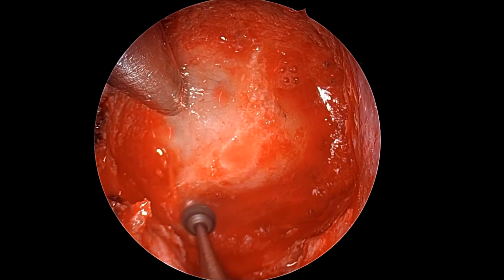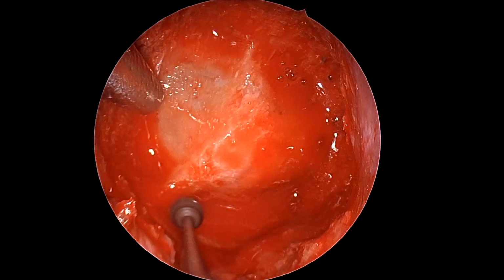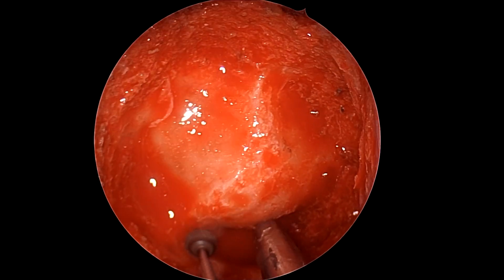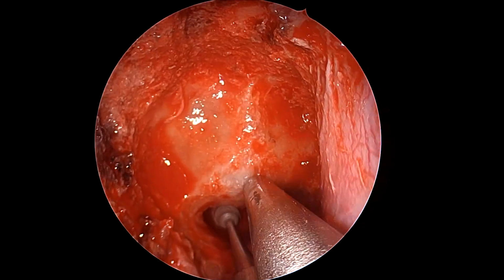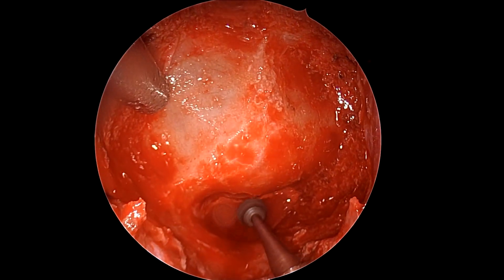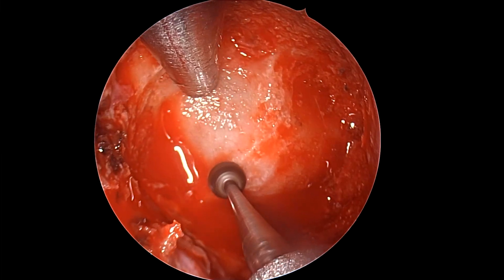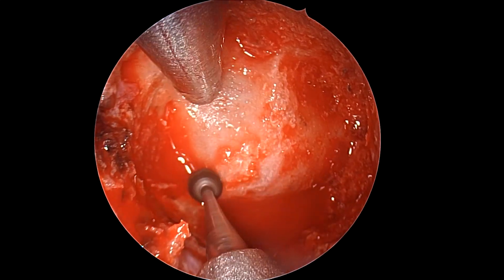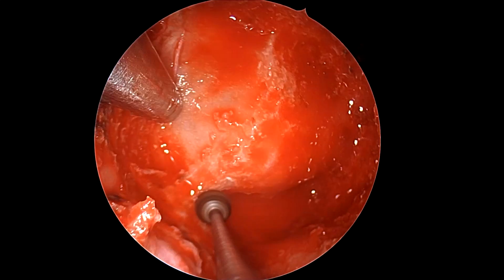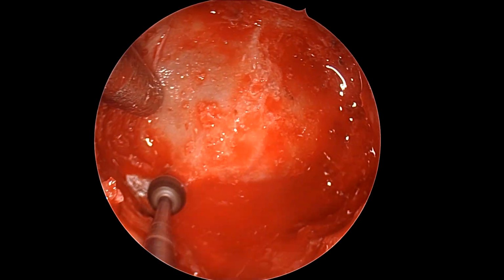So for the most part, that is not part of the plan, because as I had discussed, this is a post-radiotherapy tumor. Our goal is just near total or subtotal resection only, followed by histopathology, and then discussing if we have the ability to re-irradiate this patient. But surely we do not want to be too adventurous, because we know that in a patient who's already had radiotherapy, these tumors can behave very differently intraoperatively, and major vascular injury is a very real threat and risk.